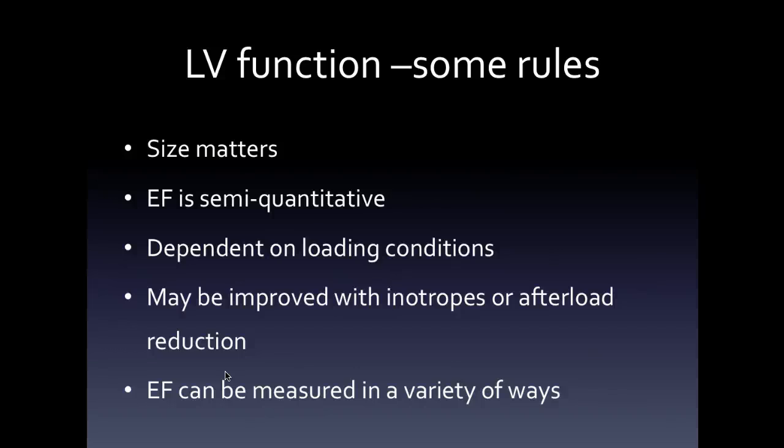The other thing, particularly in the intensive care setting, is that if somebody is on an infusion, for example, dobutamine or adrenaline, the ejection fraction you calculate will be artificially higher. And again, that's okay if you're the clinician involved in the patient, but it confuses people who just drop in and out on the patient. And I think one thing that we're probably poor on is recording whether or not the patient is on inotropes when the study is done. That's critically important and is often overlooked.